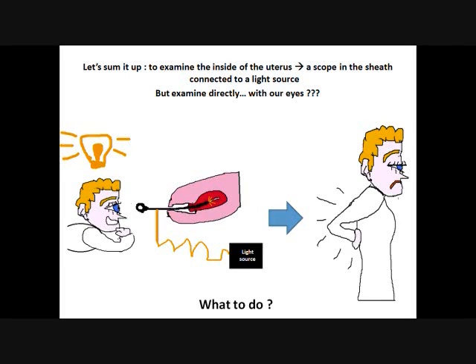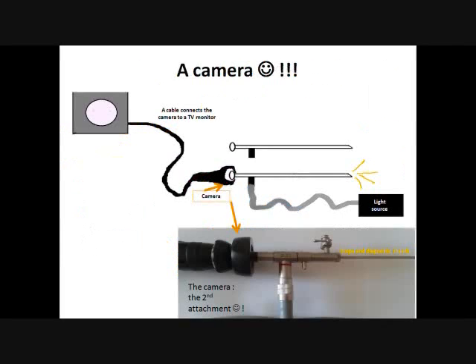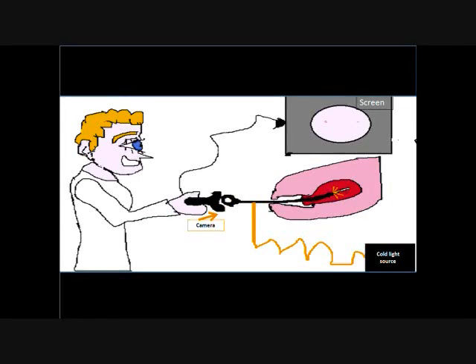So what do we do? Well, we use a camera. We put the camera instead of our eyes, and the camera will see instead of us and project everything on the TV monitor, so we no longer need to hurt our necks. So the camera is connected on the one hand to the hysteroscope and on the other hand to the TV monitor. The equipment used in this demo can be hooked up to a laptop as well, or a TV monitor. The principle remains the same. Here's a video for the demonstration.